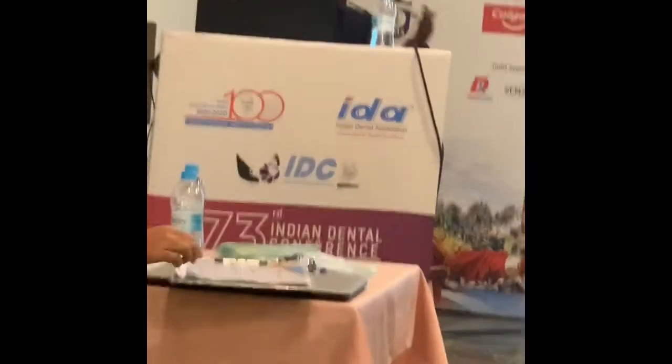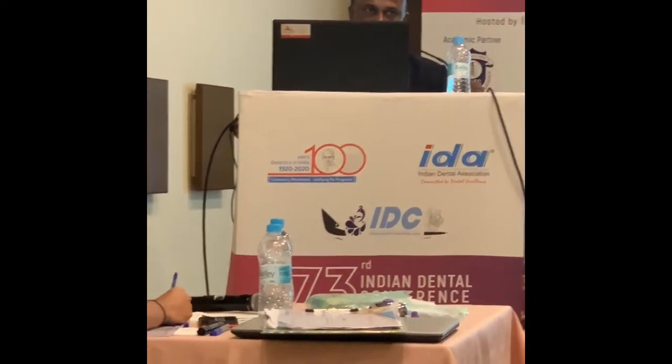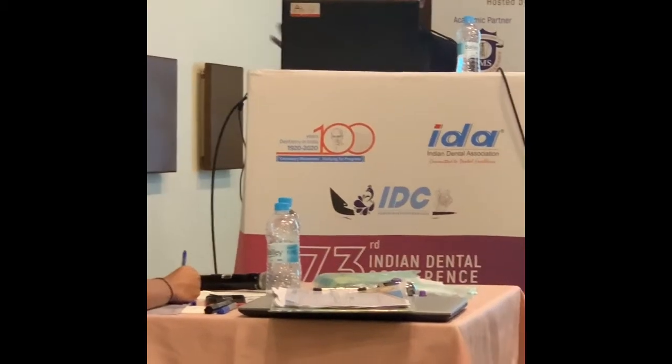But if the patient had lost a tooth for quite a long time, for example, the patient is edentulous in that particular region for about 10 years, there will be a lot of resorption. The ridge is going to be quite narrow. So you go for the advanced procedures, what can be done. So the nerve is going to be closer and the ridge is going to be narrower. If the ridge is narrow, you have to go for ridge split. If the height is less, you have to go for augmentation.